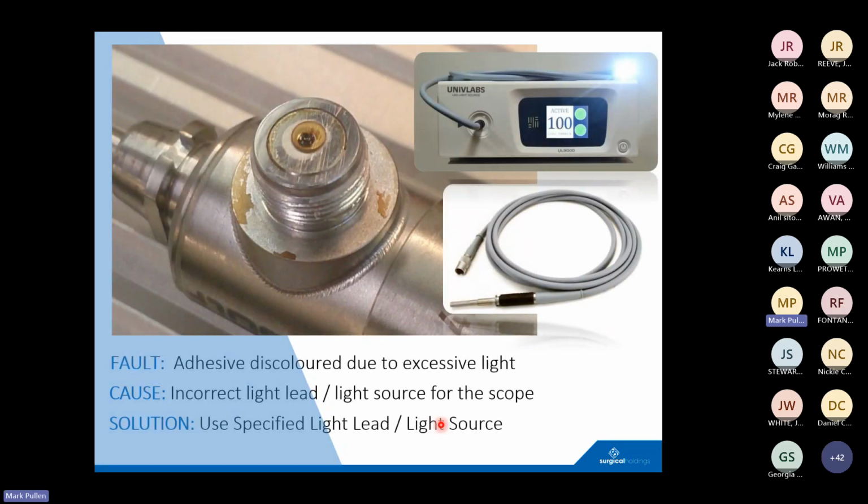So moving on, another common fault is adhesive. Adhesive is used to keep the light fibers in place, and over time or with excessive light, these can discolor, so they can almost turn orangey or give you a warm white. Causes of this could be an incorrect light lead, so a much too powerful light lead, or the light source being turned up too high for that specification of scope. So the solution is obviously to use the specified light lead and the correct light source.